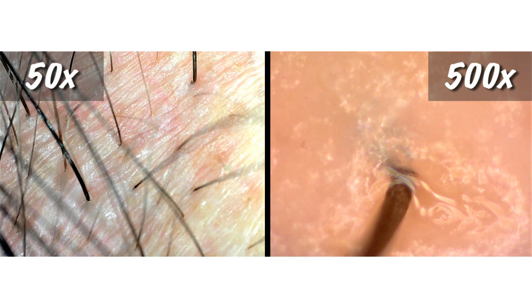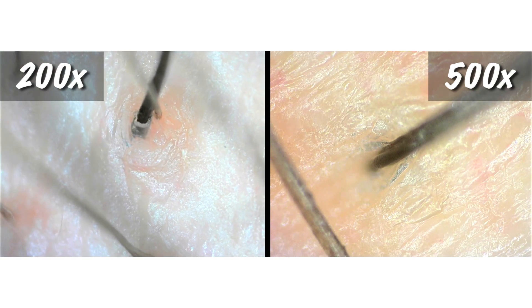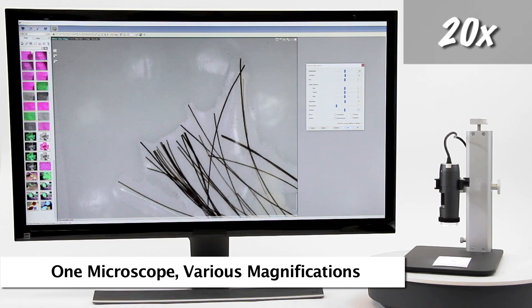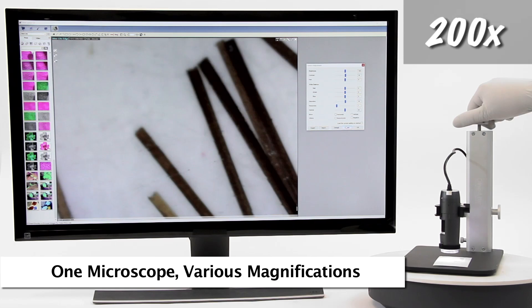All of the sample images shown were captured by Dynolite microscopes. The Dynolite can be easily used in a handheld capacity for viewing, or can also be used in a stand for additional stability and hands-free usage.